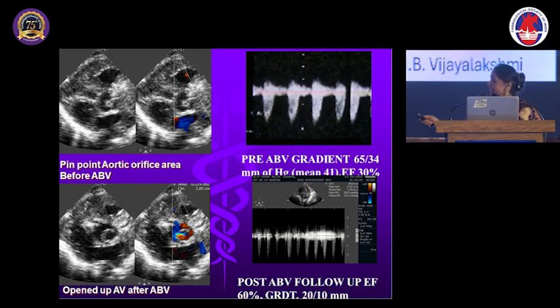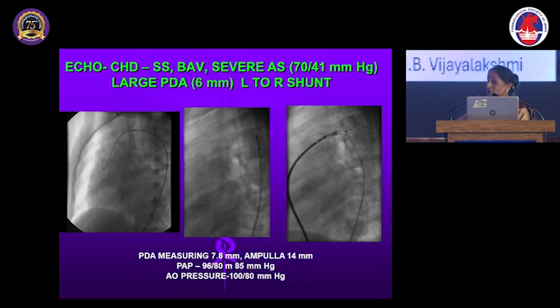It's a right heart catheter, right? From the RA, it has gone to? Yeah, the catheter has gone into LSVC, that's right. But when the dye is injected in the LSVC, where is it going? That's the important part. I showed you earlier. Coronary sinus, then LA, then LV.